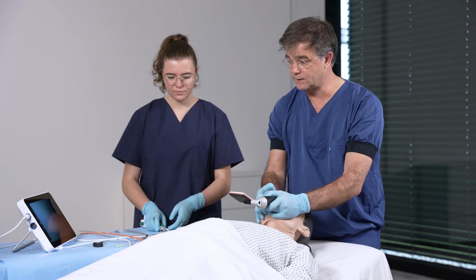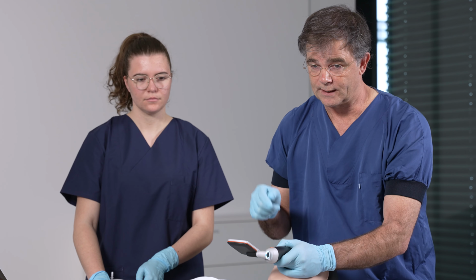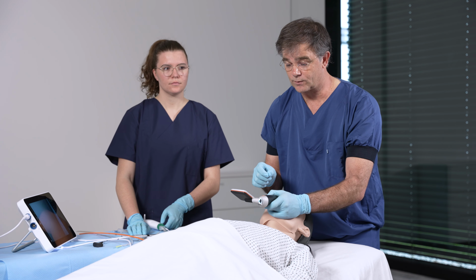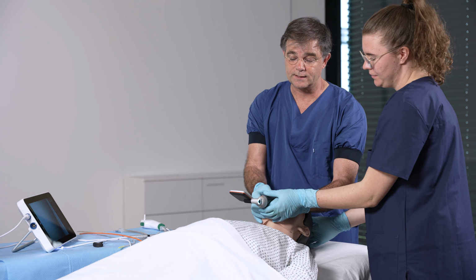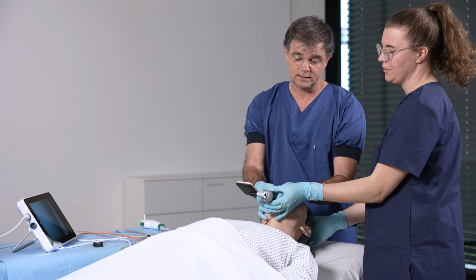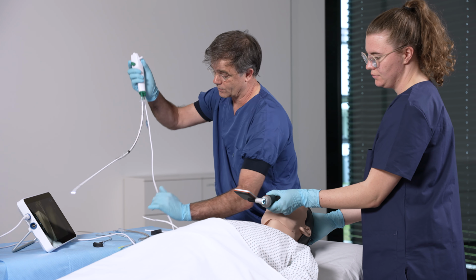What we need here is an assistant and we need a flexible scope. We will look at the video laryngoscopy screen to introduce the flex scope into the trachea. Could you hold the video laryngoscope for me, please? Sure. It's very important to instruct the assistant to hold the scope like this, exactly what I do. Can you hold it like this, please? Yes? Okay. Then I will use the flexible scope.